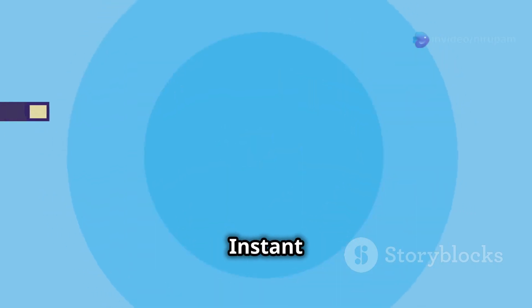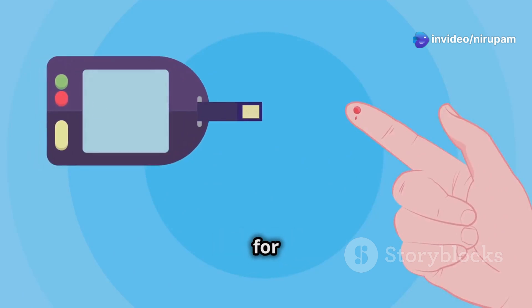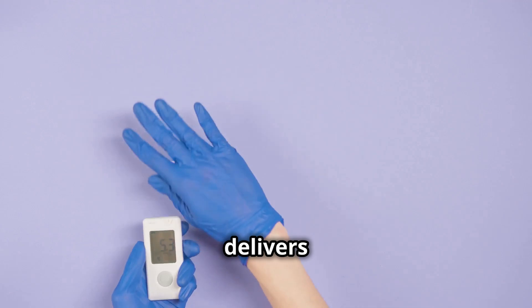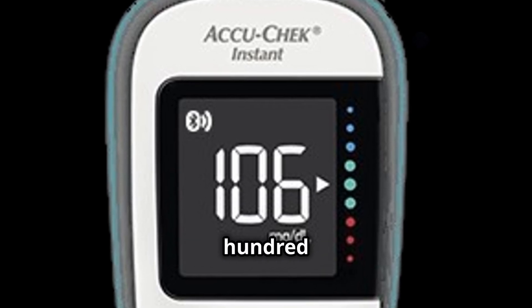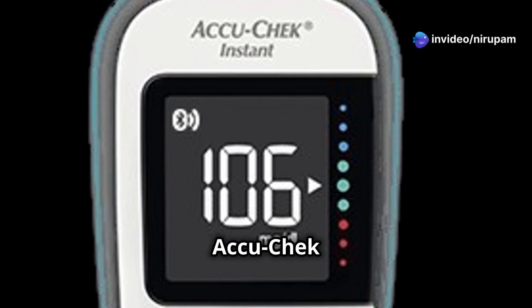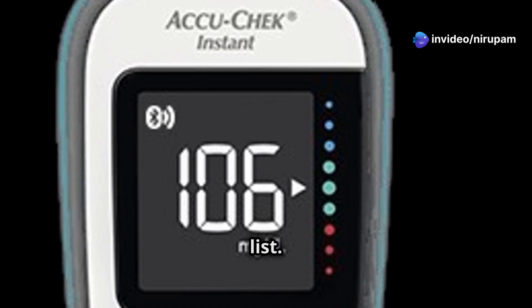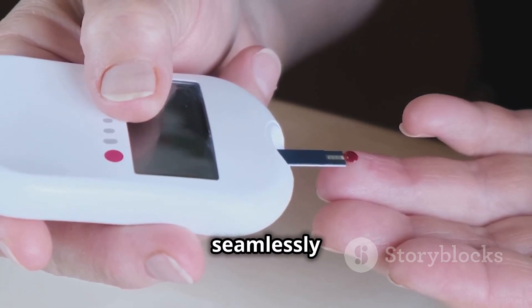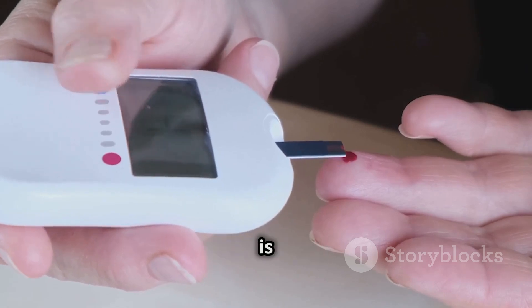The AccuCheck Instant Wireless Glucometer also boasts a large LCD with a backlight for easy reading, even in low-light conditions. Plus, it requires a tiny blood sample and delivers fast and accurate results. At approximately 1,349 rupees, it is the most expensive option on our list. If you're tech-savvy and want a glucometer that integrates seamlessly with your digital life, the AccuCheck Instant Wireless Glucometer is a top contender.